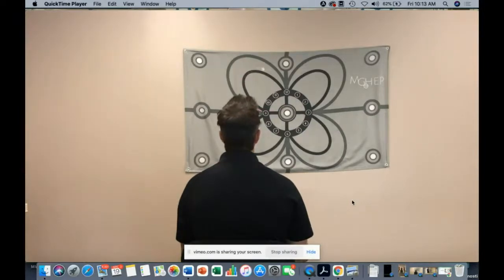If this was very dysfunctional, there's different things that we can look at here. So you can look at precision, and not only precision on the line, but precision in hemispheres. So above the line or below the line might tell you more temporal versus parietal involvement. Right versus left side, so a cerebellar being an ipsilateral decompensation might tell you if there's a right versus a left side issue working around this type of target.